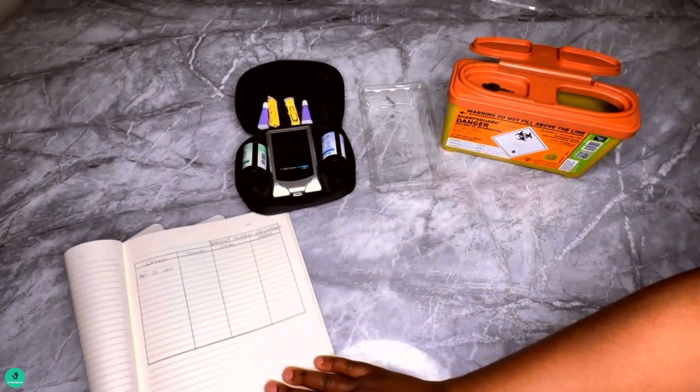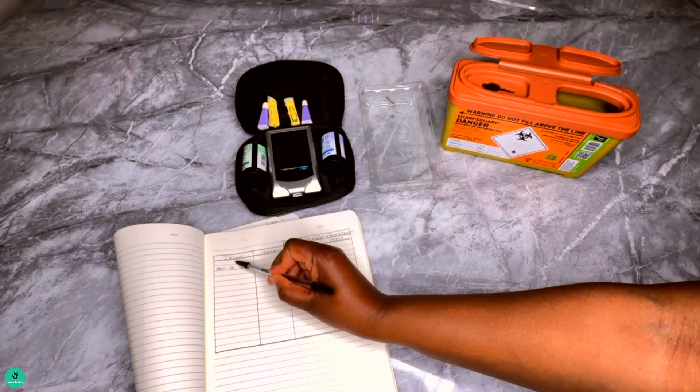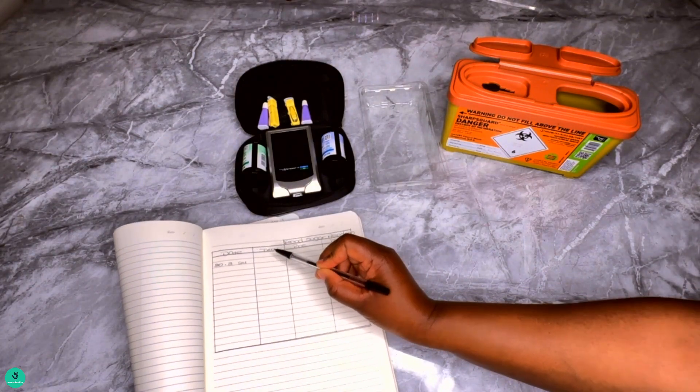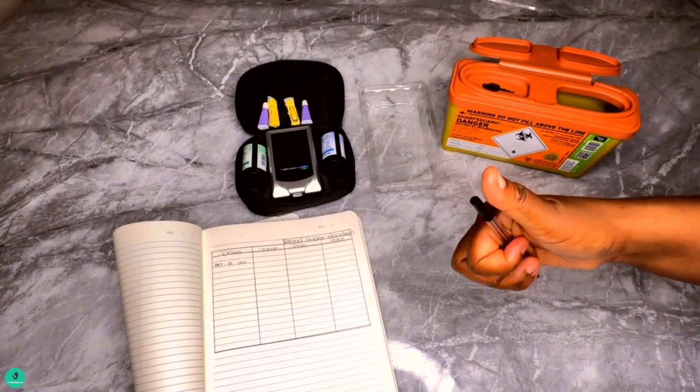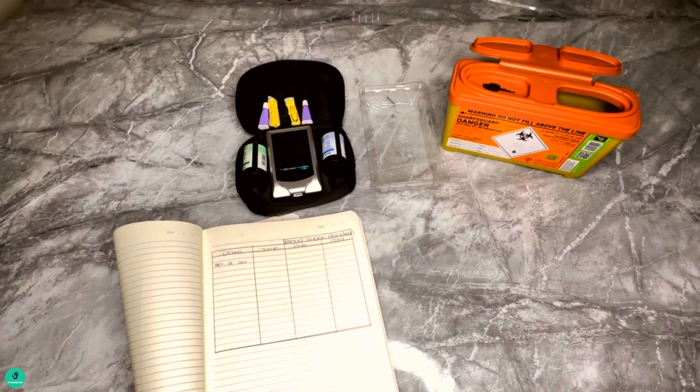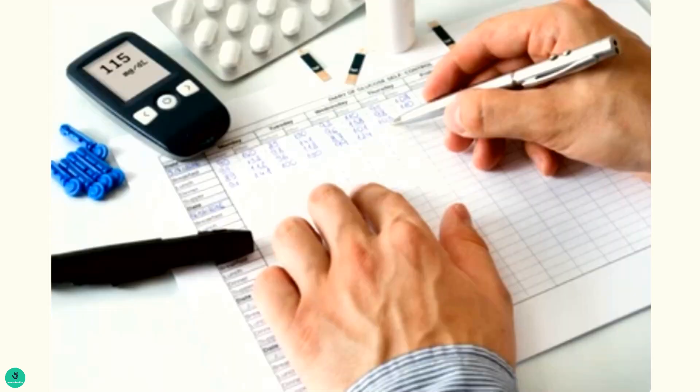Number ten: record the results in a monitoring diary or your notebook. It's best practice to include the date, the time, and the blood sugar readings — that's pre and post. Pre means before breakfast, before lunch, or before dinner, and post means after you've had something to eat.